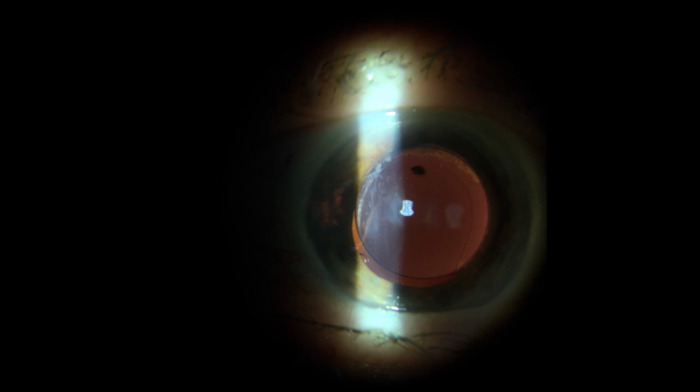So I'm going to go ahead and take this lens out, but you're going to have to ask yourself, why did this surgeon put this single piece acrylic lens in the ciliary sulcus? And so you will discover with me why this lens was placed in the ciliary sulcus. And then my decision after I remove this lens: where am I going to put the new lens? Am I going to try to put it in the capsular bag? Am I going to try to put it in the sulcus? Which lens type am I going to put for each of these decisions?